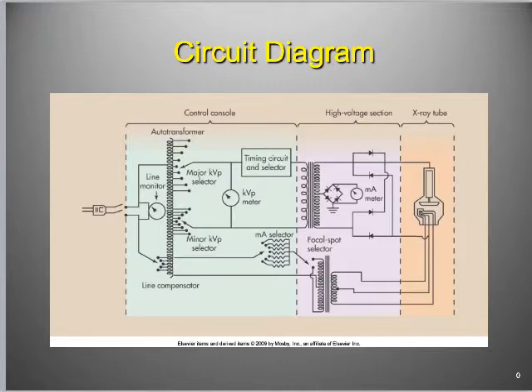But yeah, we'll look at videos on YouTube real quick, and you'll get a chance to see what it looks like when this thing is glowing. It glows bright red. It's very hot. And the term for that is thermionic emission. It's emitting ions or electrons through heat. The exact same thing is happening, interestingly enough, when you toast your bagel or whatever, right? When you push down the toaster oven, thermionic emission is what's occurring inside the filaments of the toaster. We're just doing it at a much hotter level inside the X-ray tube.